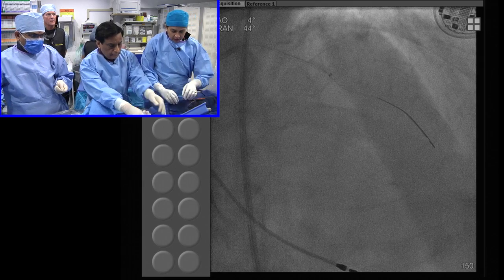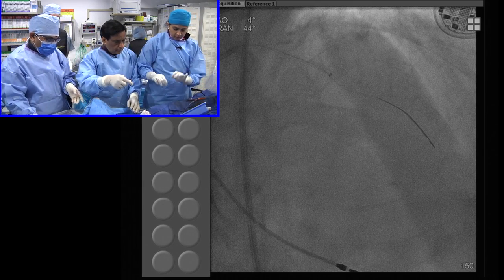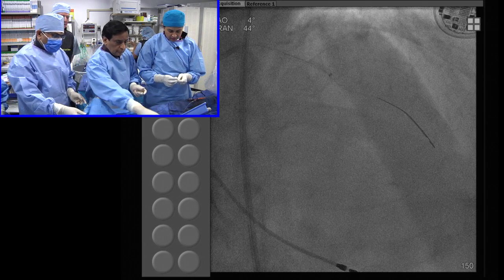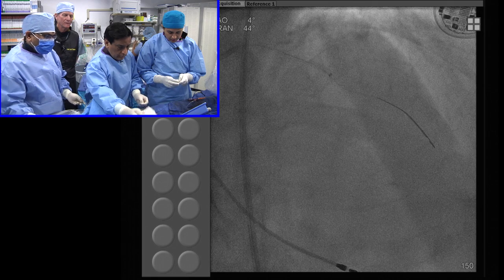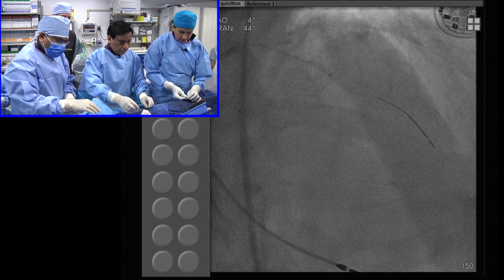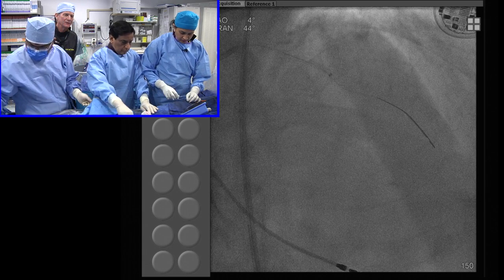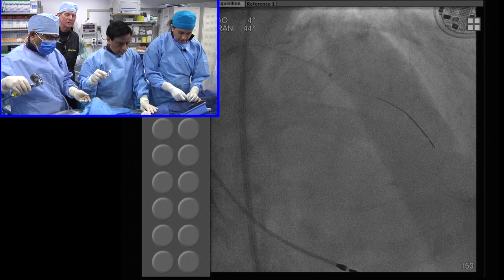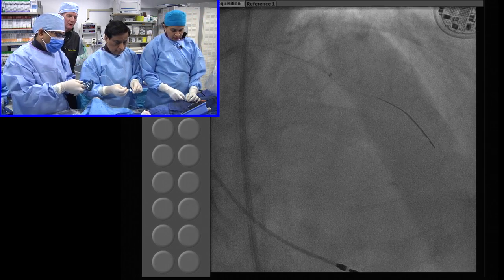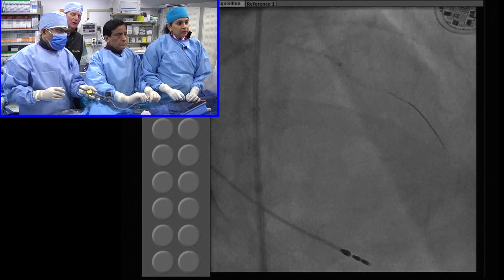Get the same balloon? Chuck, has Abbott Vascular been proactive in helping the reimbursement issues? Yes, you mean outside the U.S.? Right, and even in the US? Yes. But not so much for drug-eluting stents. Absorb currently is in the category of DES, even though it's a very unique and different technology. We'll need to show superiority in an endpoint that would impact the cost of care.